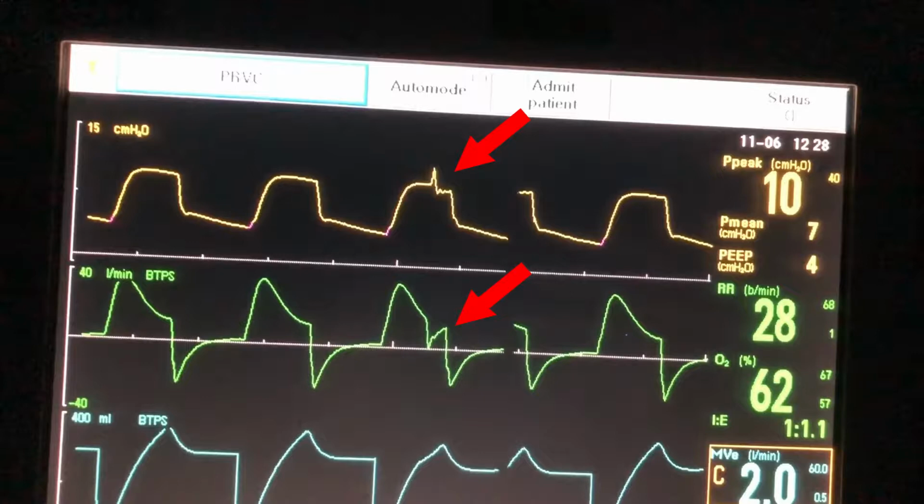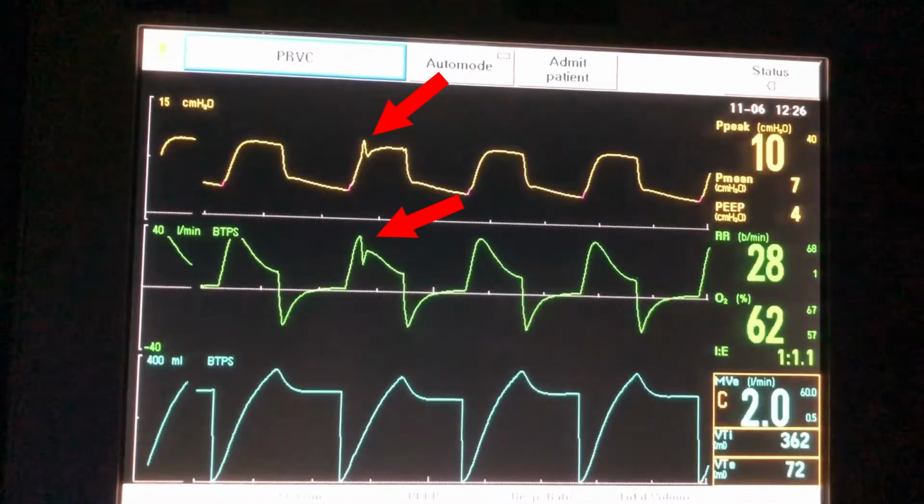Manual administration demonstrates actuation of the metered dose inhaler in the mid-inspiratory cycle during a low flow state, while actuation by the Go Pilot demonstrates early MDI actuation during a high flow state.